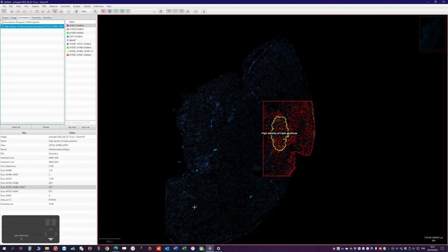And so now we know on these slides where those triple positive cells are located. This is a nice way to do an analysis, and since we didn't draw anything manually besides this region, but we could have done that on the whole tissue here, but it would have taken too much time. That's why I've limited this here. We know now, without any manual input, where our triple positive cells are, which is I think the best way to do this kind of analysis.